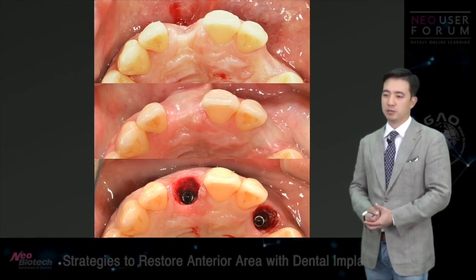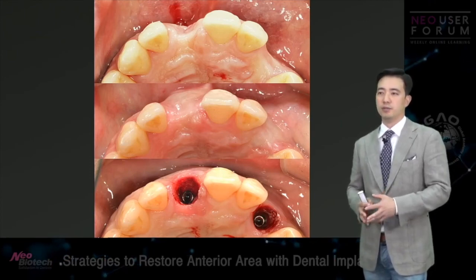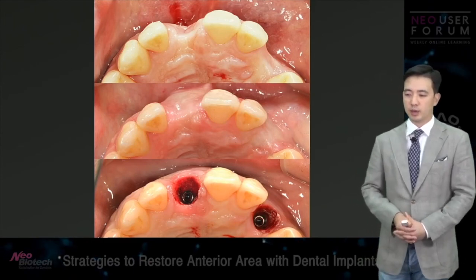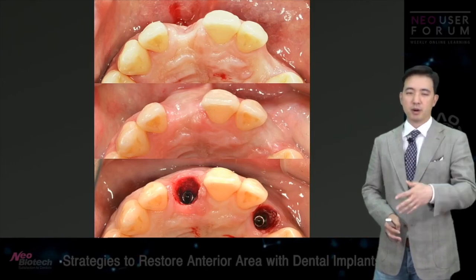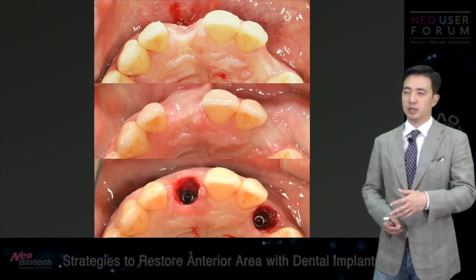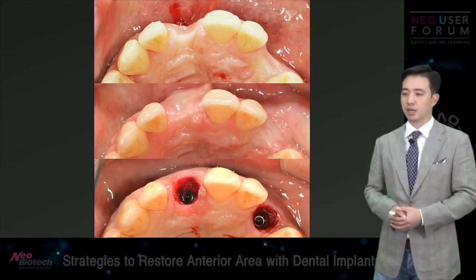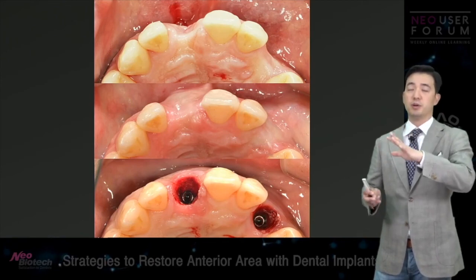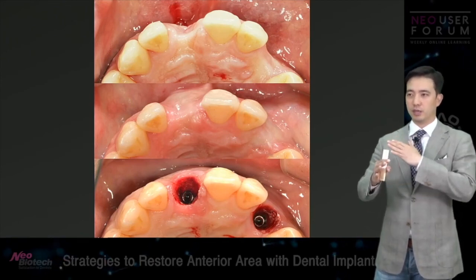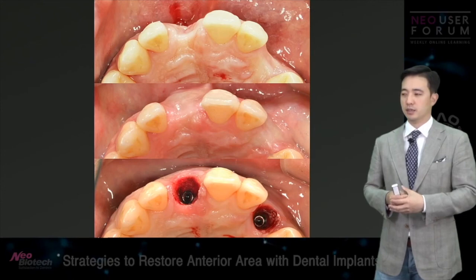Going back to my previous presentation, I showed one of my cases with the CT scan of, I think, 2-year follow-up. What happens is the buccal part of the root gets ankylosed with the bone. It sticks into the bone, and you can't really tell from the CT scan which part is the root and which is the buccal bone. You can't really separate it on the CT scan, so it gets ankylosed, I think.